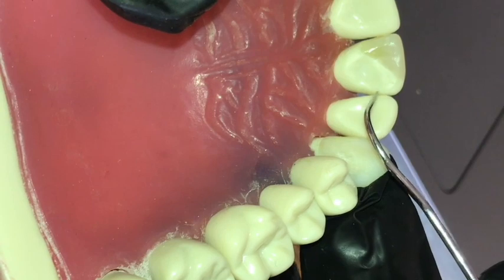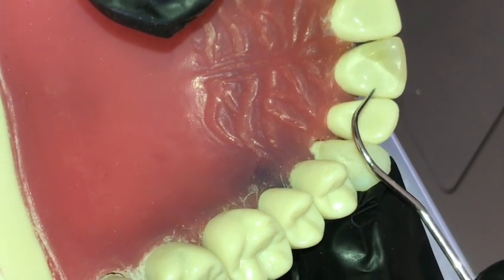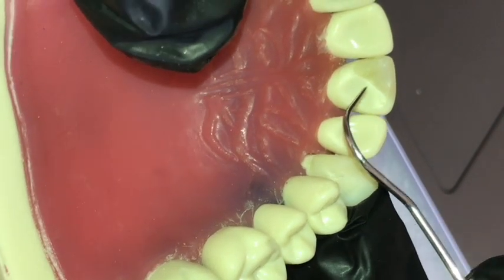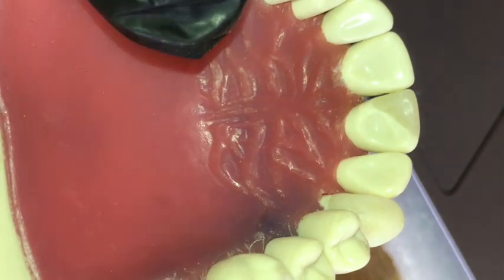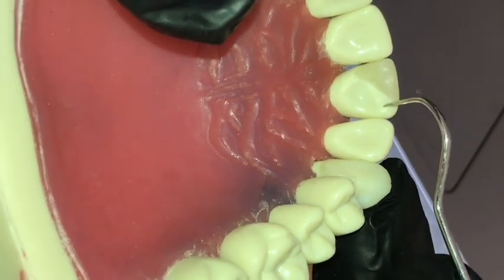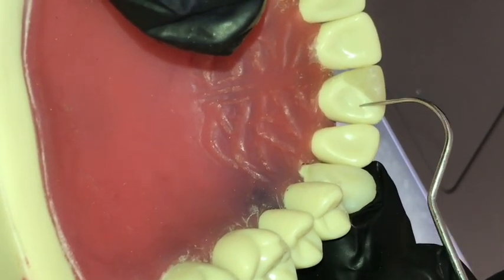Looking at your restoration from a palatal view, probably another important factor. See that light reflection that's making something like a triangle? This is exactly what we want, and that's how we know we have duplicated the natural tooth contour, because that's what the natural tooth should look like.